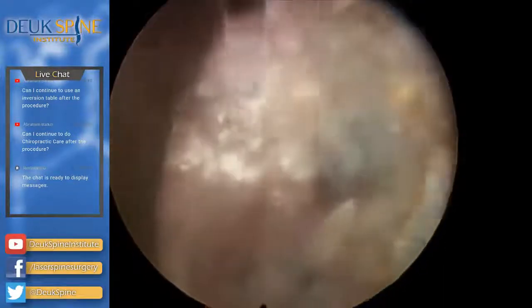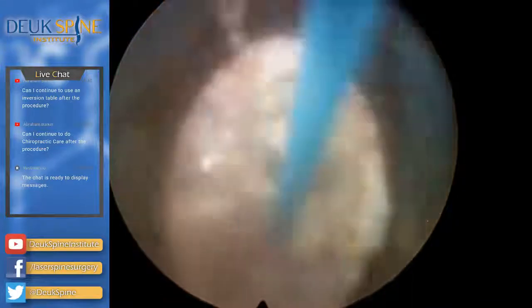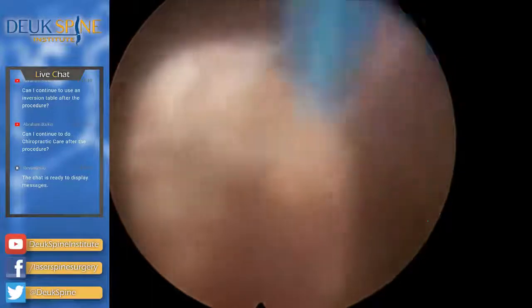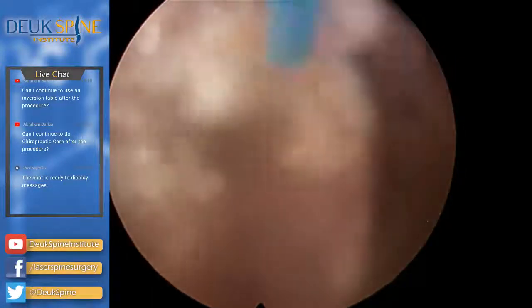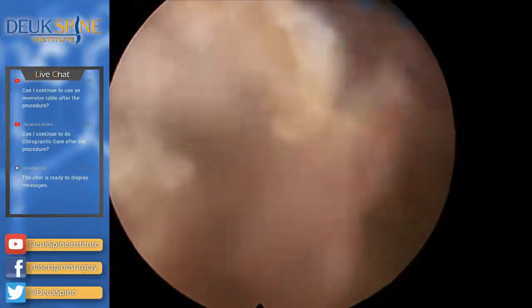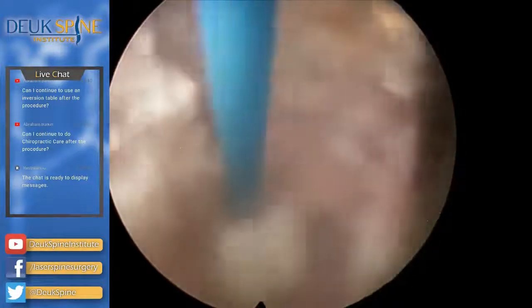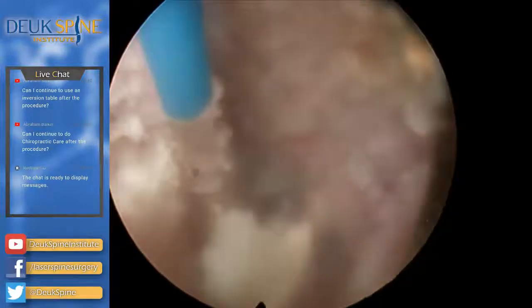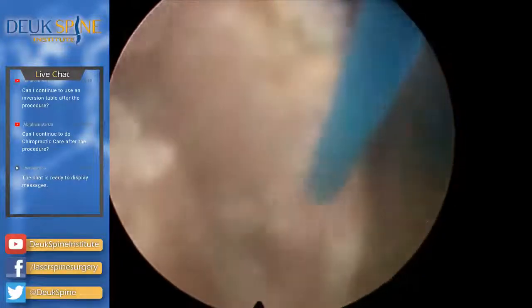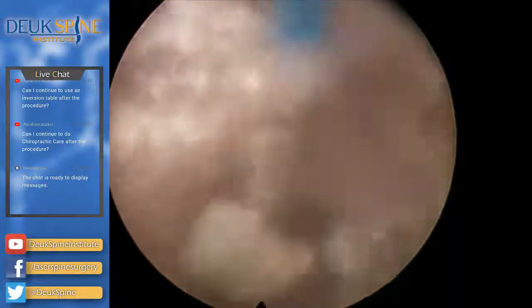We are at the L5S1 disc, and you can clearly see back here there's a tear. There's really not a lot of disc left at all. It's almost bone on bone, but there are some bone spurs here that I'm getting rid of with the laser right there. That's a bone spur. And it's right where the nerve is, just underneath it. So there's some old chunky herniation, which we'll grab with the grabber because it's not going to float out. More bone spurs.